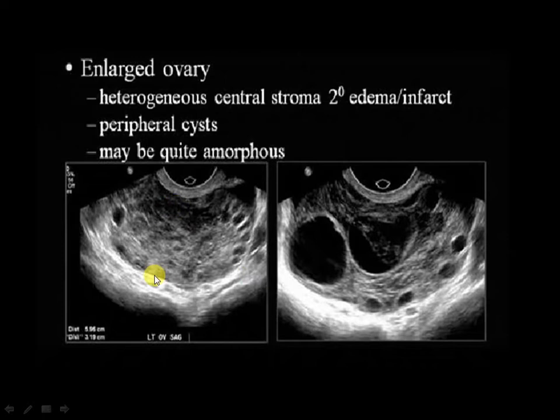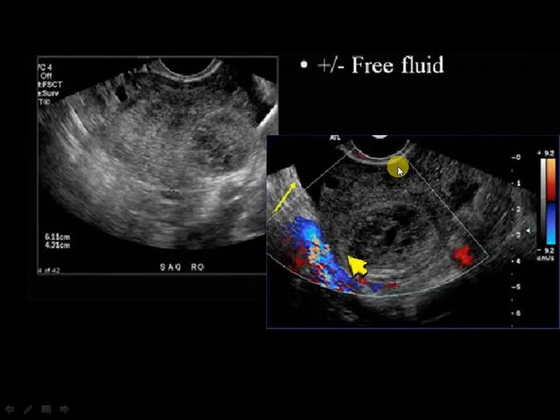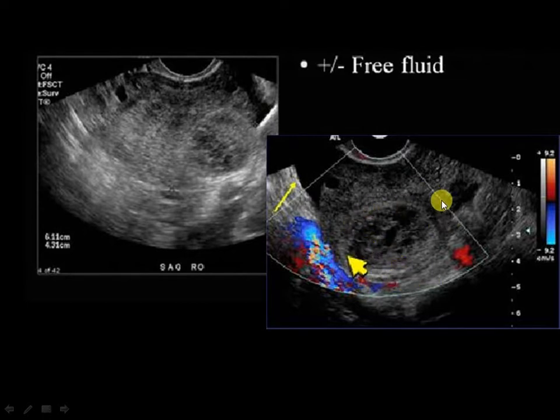On grayscale ultrasound, the ovary appears large, heterogeneous, with multiple peripheral cysts and can be amorphous. The ovary may be seen in the midline rather than in the right or left side. Check for an underlying mass as the cause of torsion. Asymmetric thickening of an ovarian cyst wall with a dilated tube forms what is called a target sign. The enlarged ovary is avascular — with Doppler you cannot see any internal vascularity, similar to testicular torsion.